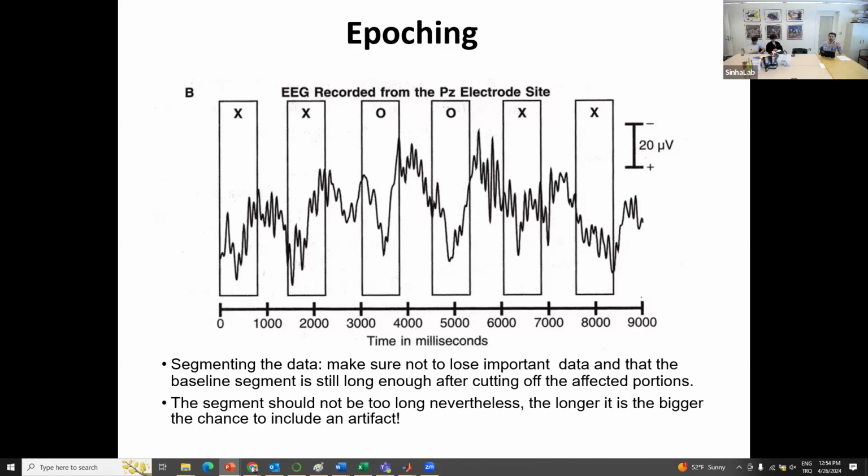They also become desynchronized or dephased with respect to the original source signal you're trying to estimate. Unfortunately, that would make your signal essentially useless, because if you have a phase difference and you sum the signal, it will basically give you nothing. You can't observe any information content.